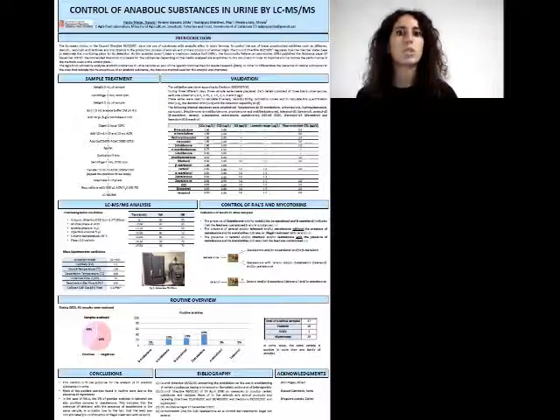These series were used to calculate reproducibility, trueness, calibration curves, quantification limits, the decision limit, and the detection capability. Different internal standards were established for families. As can be seen, for some analytes qualitative analysis is established, and for others quantitative analysis.